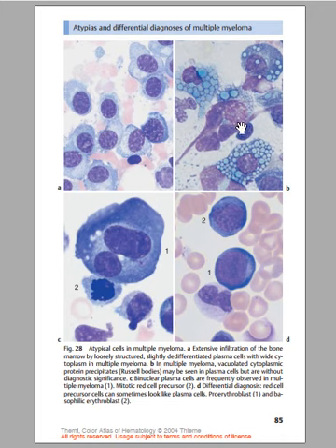So just that make you think also of a plasma cell tumor, and in this case it's going to be multiple myeloma. So that's in diagram B. So in diagram C now, you have this. In this case you have 2 nuclei. Is it clear? In diagram C, it's a binucleated plasma cell and these are frequently observed in multiple myeloma.